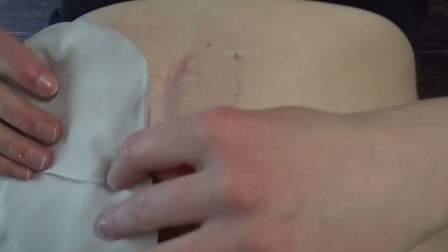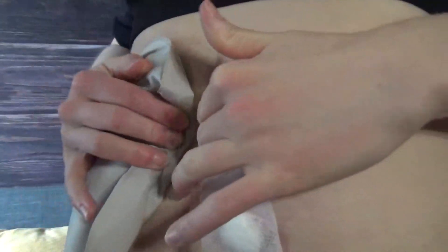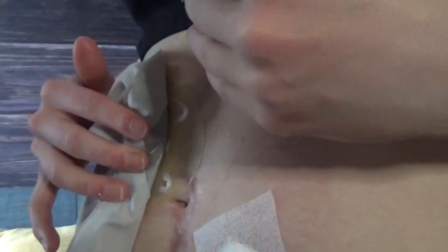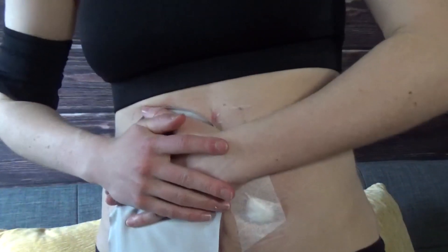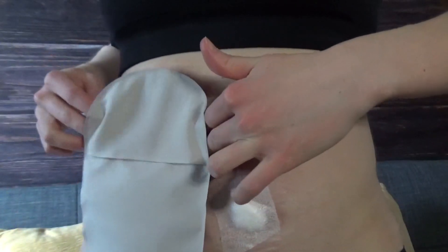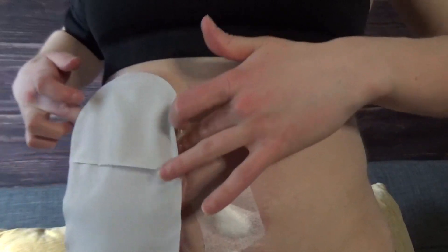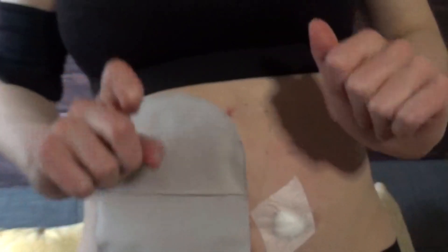Now I'm going to put on my bag and press it down really nicely. I have a little problem area around the midline — some slight bumpiness that makes it difficult to get a flat seal. Anywhere you have a problem area, just push it in extra well. You don't want to hurt yourself, but you want to make sure you're getting a nice, strong, hard seal.